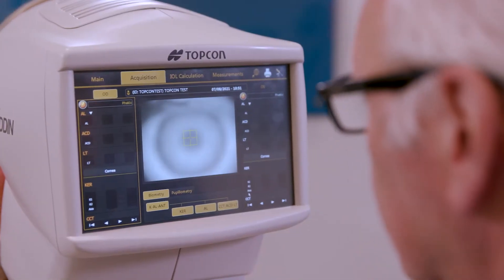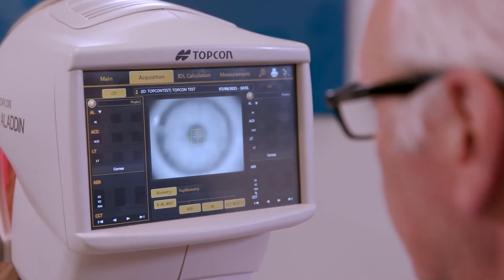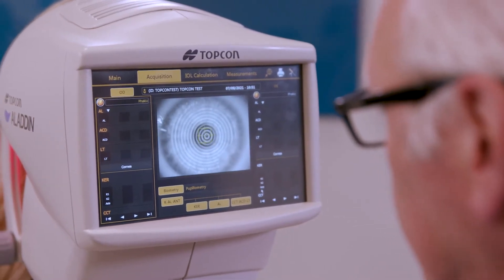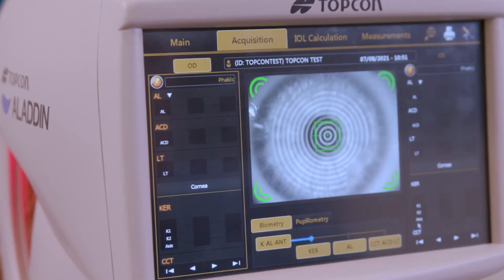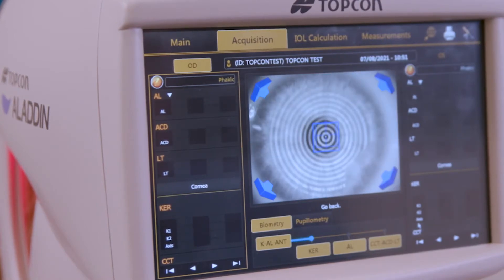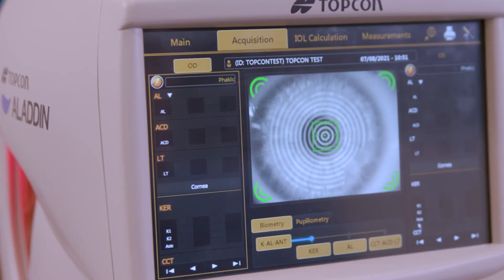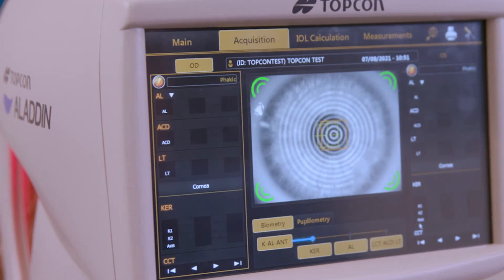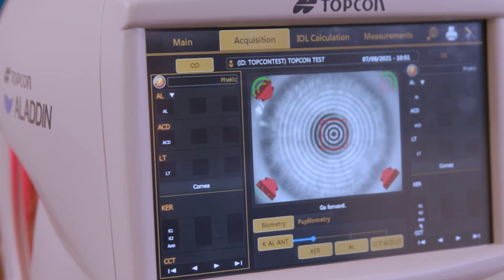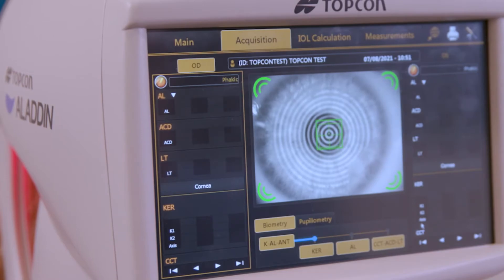For the capture, we have the yellow square. We move until we see the Mires clear and we press the first time. We need to have the four corners in green and the two squares in the center overlapping and both in green color. If you move them and they become yellow, you can still get a measurement, but it's not going to be as accurate.